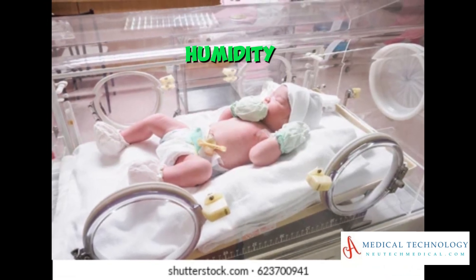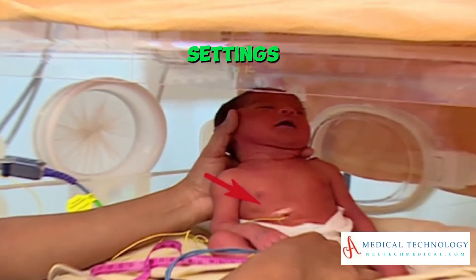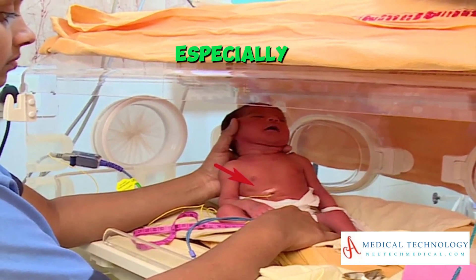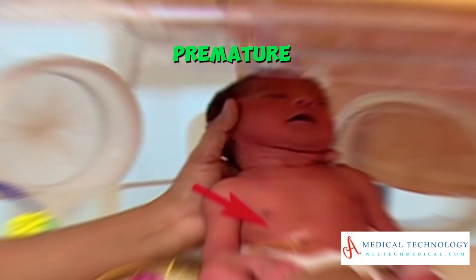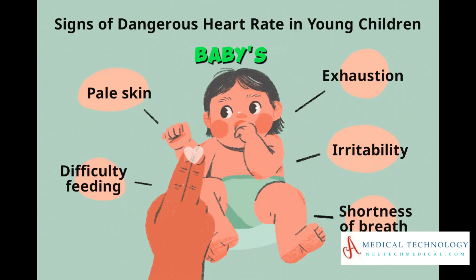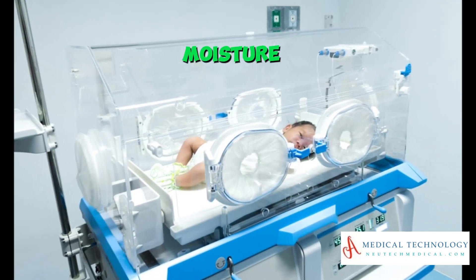Humidity control: Adjust the humidity settings to prevent dehydration, especially for very small or premature infants. Regularly check the baby's skin for signs of excessive dryness or moisture.